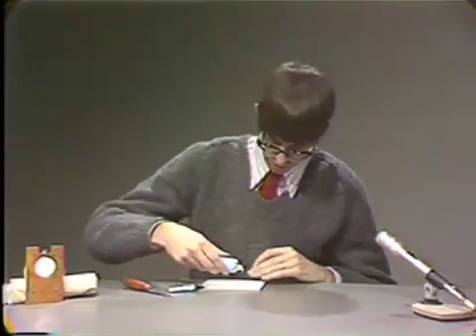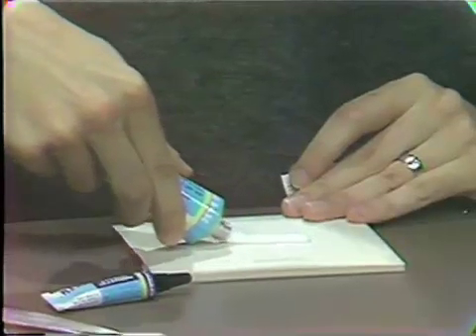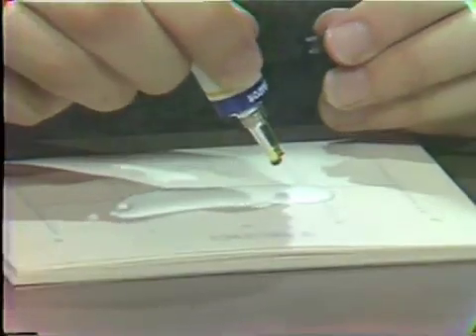First we will add two inches of the base material, and notice we try to get an even flow of material from the tube. We will then add two drops of the accelerator, and notice this is a viscous liquid.